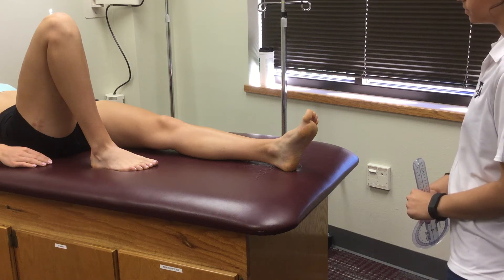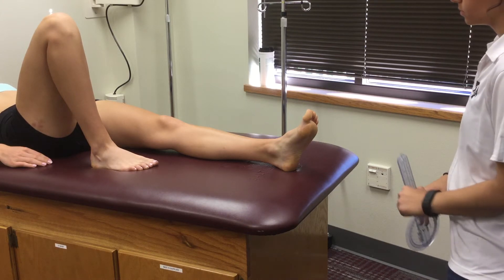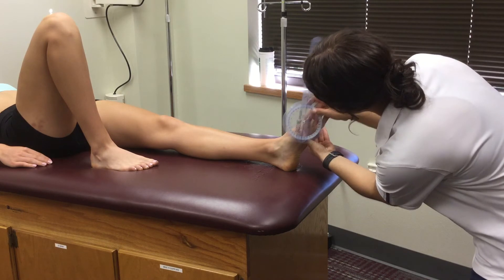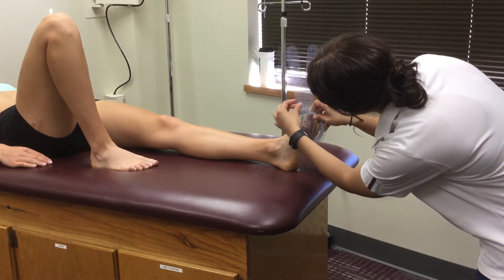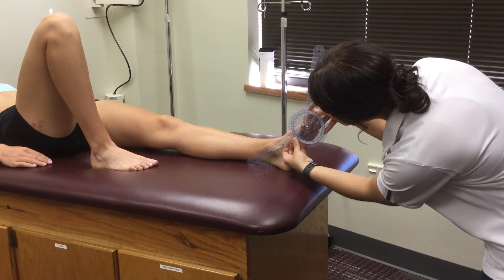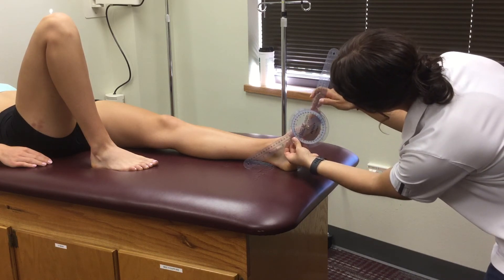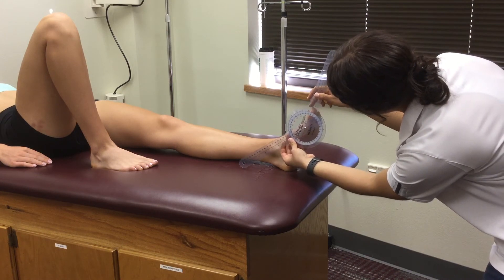Position the patient lying on the table in a supine position with the legs in full extension. Place the fulcrum at the metatarsal phalangeal joint line of the first toe, with the proximal end aligned with the first metatarsal pointing towards the ankle and the distal end along the line of the distal phalange.